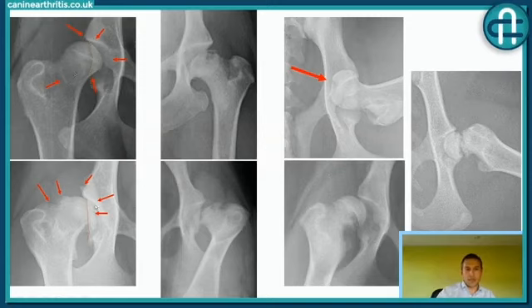And here is a more advanced stage of hip dysplasia, and you can see that now you have a lot of remodeling of the head, a lot of osteoarthritis, some bony proliferation. So that's the most common presentation, hip dysplasia in dogs. And then you have more.